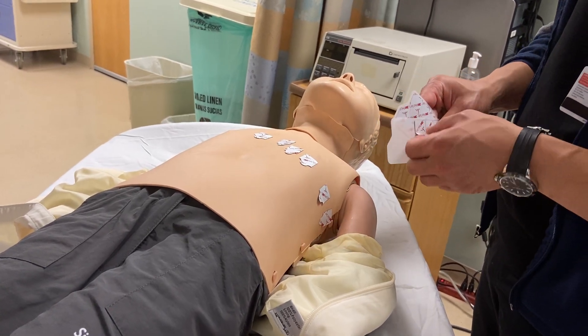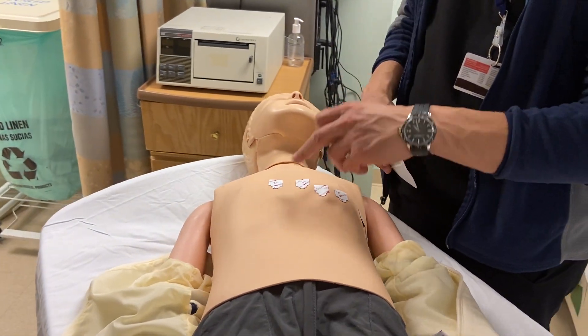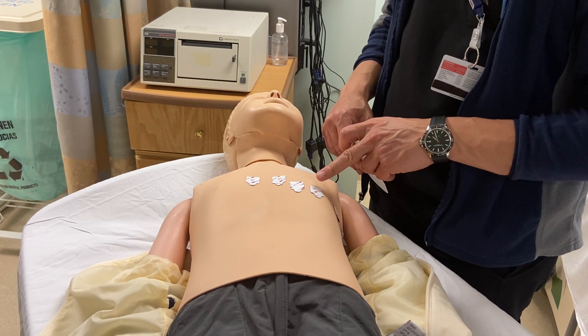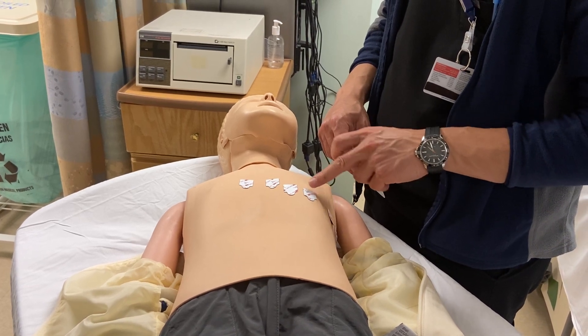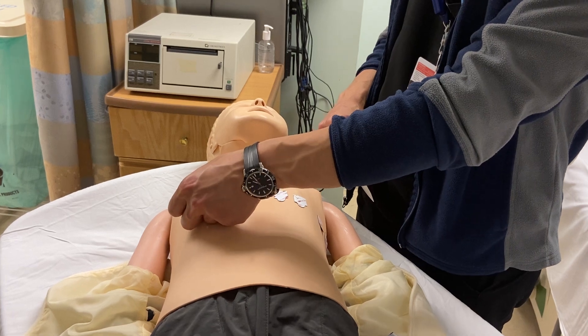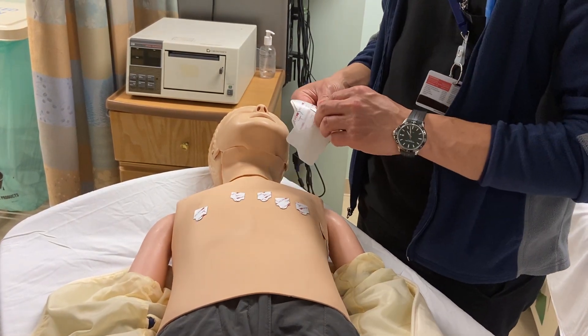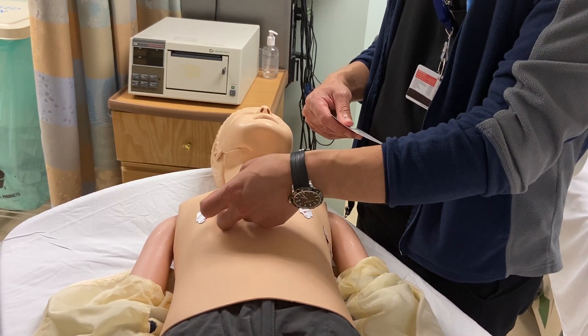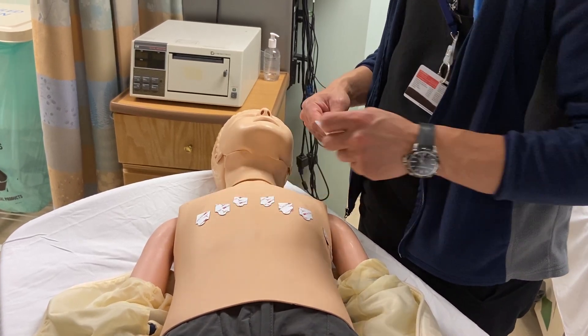For children, we usually also place V3R and V4R. V4R will mirror V4, so it'll be in the fifth intercostal space, mid-clavicular line, but on the right side. V3R will also mirror V3, so it'll be in between V1 and V4R on the right side.